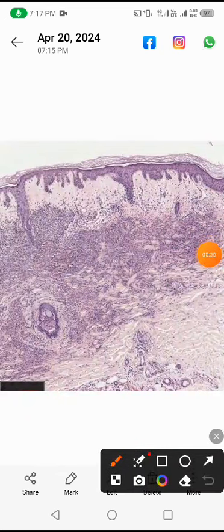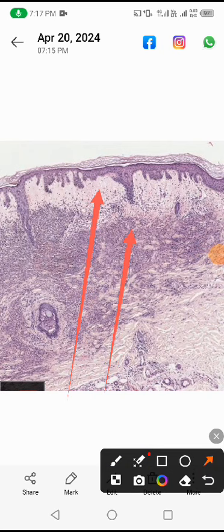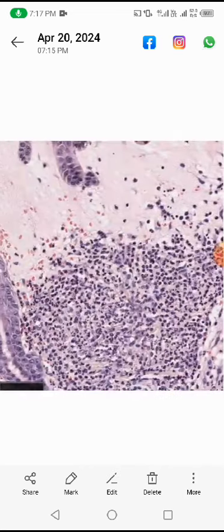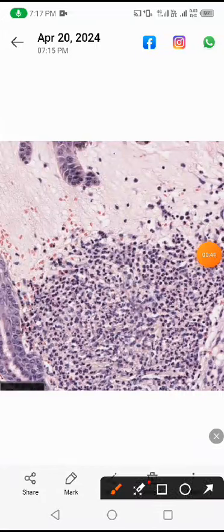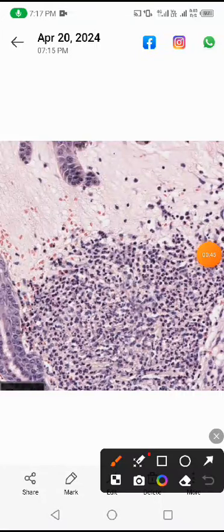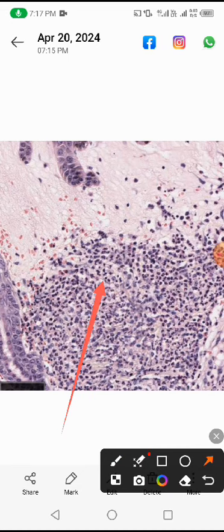This is another picture showing the papillary dermal edema and dense inflammatory infiltrate involving the whole dermis. There is also perivascular inflammatory infiltrate.